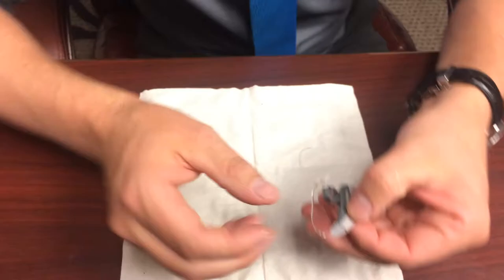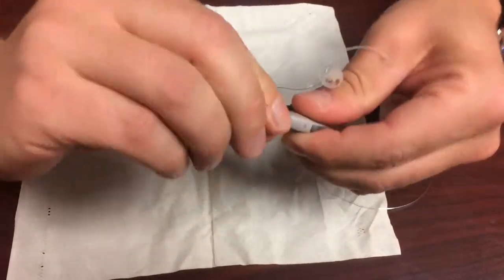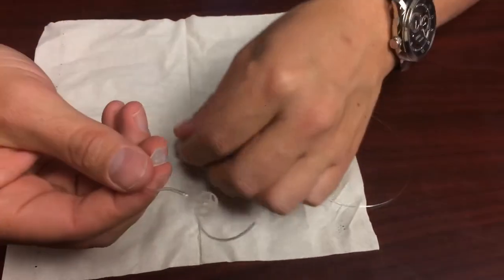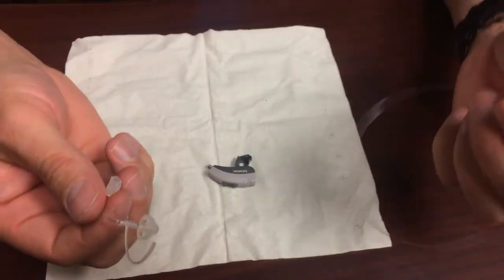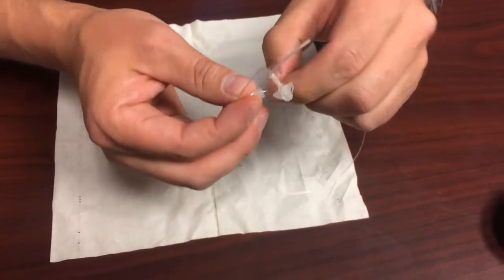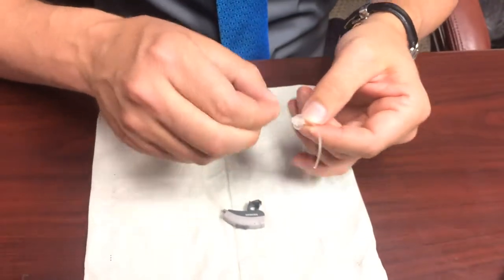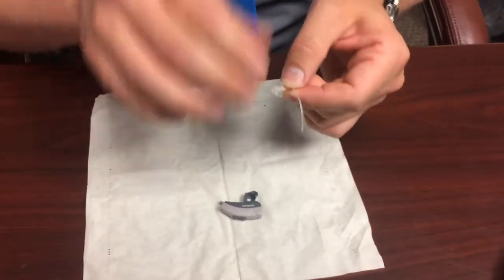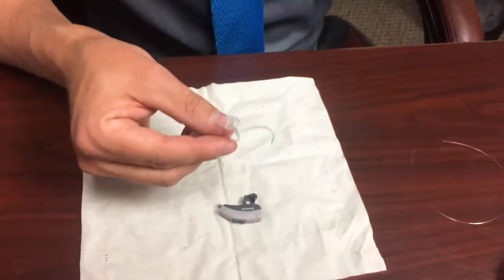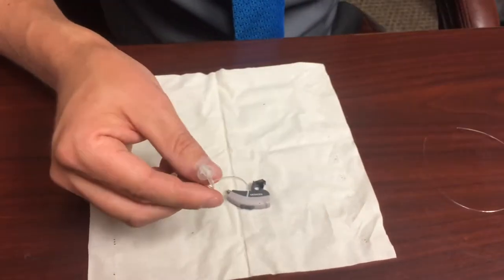Most of the time what's going to happen is you're going to get wax plugged up in here. This is just a little hollow tube and it will unscrew just like that. You can take a piece of fishing line and just run it through from the hearing aid side to the ear side, and that will help push out any remaining wax. I'm going to spin it as I pull that piece of fishing line through and then wipe it down again to get out any wax that's stuck in there.